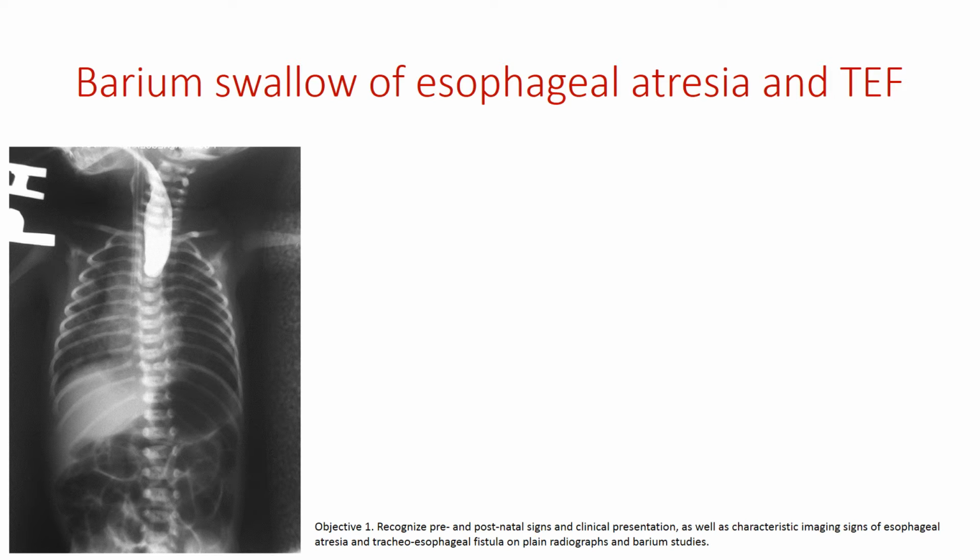There's no reason for it usually, and the patient will regurgitate the barium and can possibly aspirate, or if it goes to the tracheoesophageal fistula, it can aspirate, and that could lead to problems within the baby. But if it's absolutely necessary, if for whatever reason the diagnosis is difficult to make, you can do barium swallow as long as you're at a place that can do some emergency surgery on this patient and get that barium out that needs to come out.